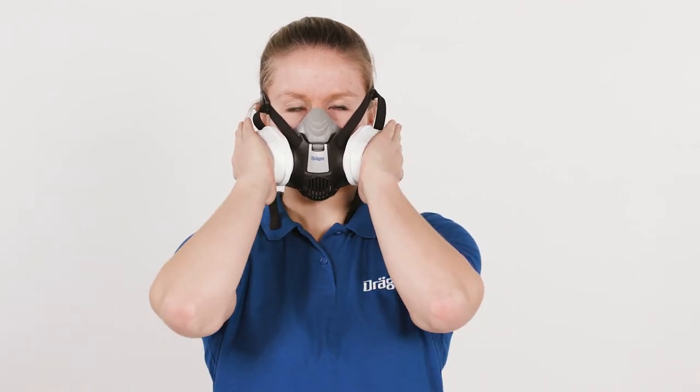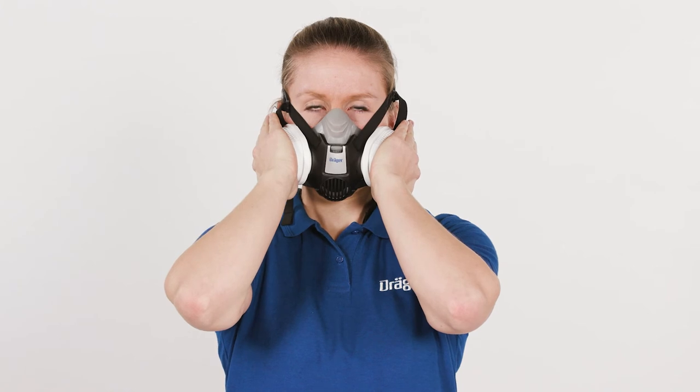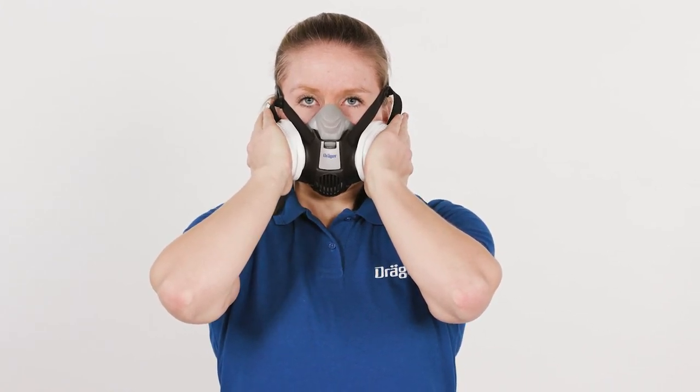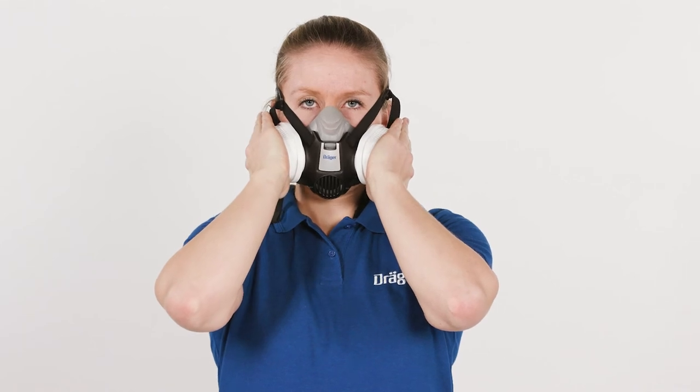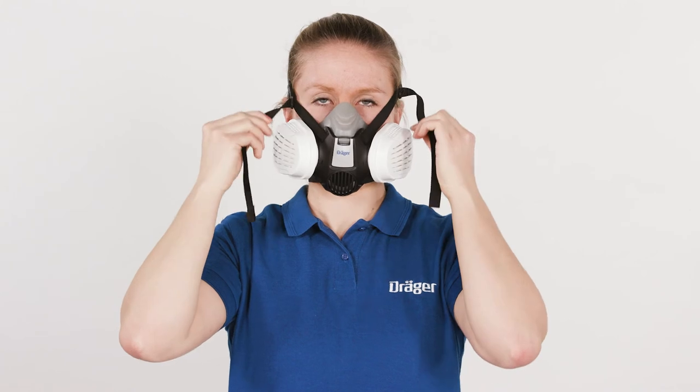Before use, you need to perform a leak test. For the negative pressure test, seal both respiratory filters with your hand or an aid — for example, a piece of cardboard — and breathe in until a negative pressure is created. Hold your breath for a moment. The negative pressure should be maintained. If not, adjust the harness.